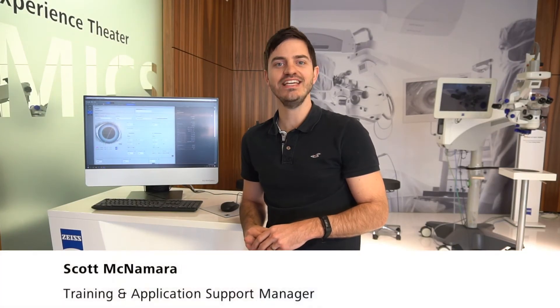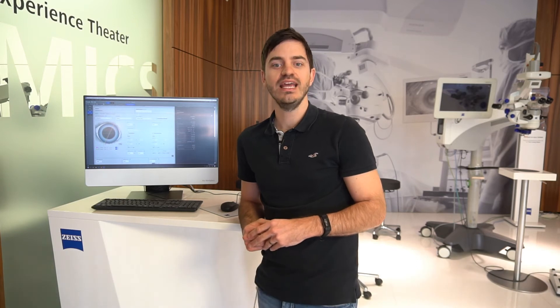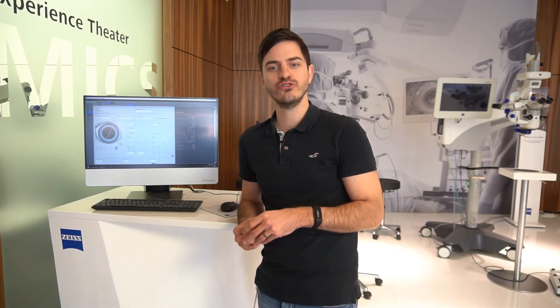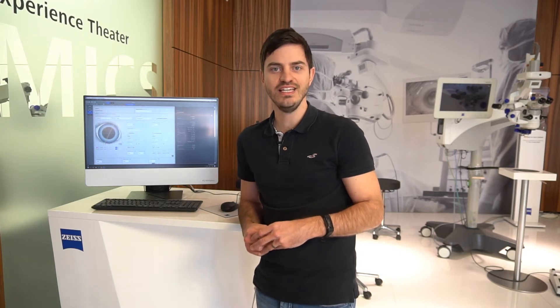Hello and welcome to the Zeiss EQ Workplace tutorial videos. In this video we will show you how to do a surgery planning with Zeiss EQ Workplace.